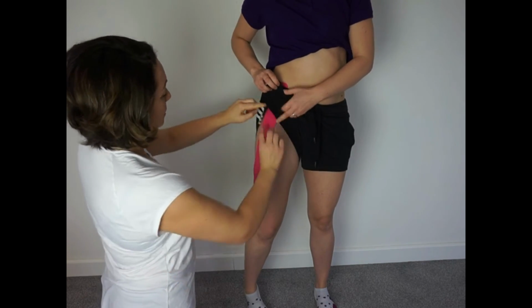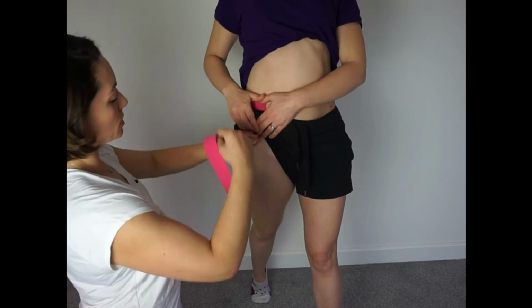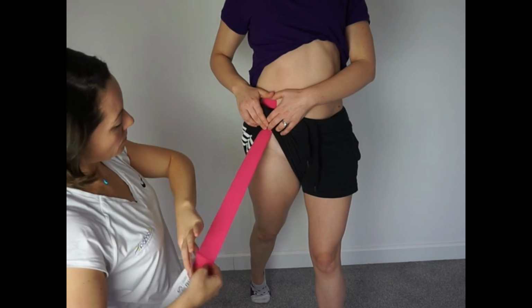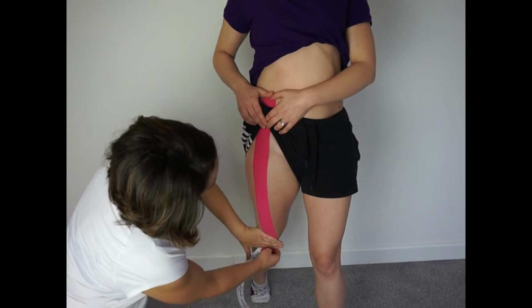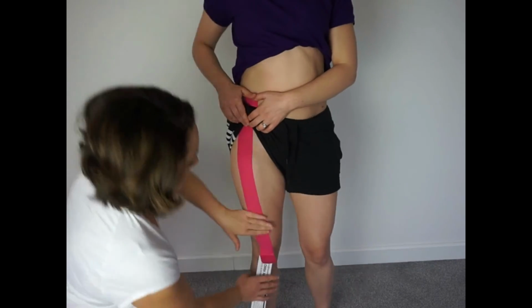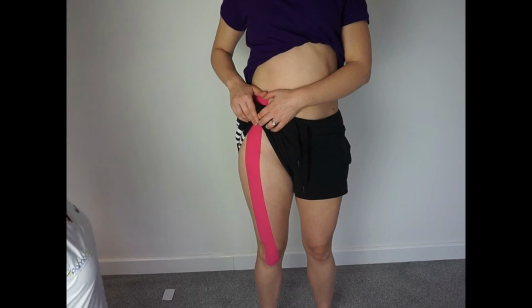That's it. Now get your client to hold that up so that you can tape from the front of the hip down. So they're just holding their shorts and their pants. Peel back the middle of the tape. Now, light amount of stretch and into hip extension again, so tissue on stretch. Follow the line down the front of the leg and then simply anchor with no tension, rubbing well to stick.